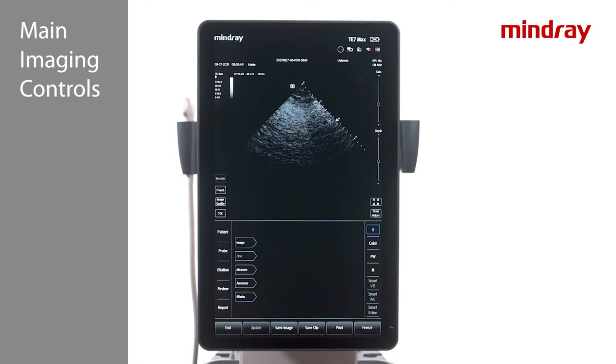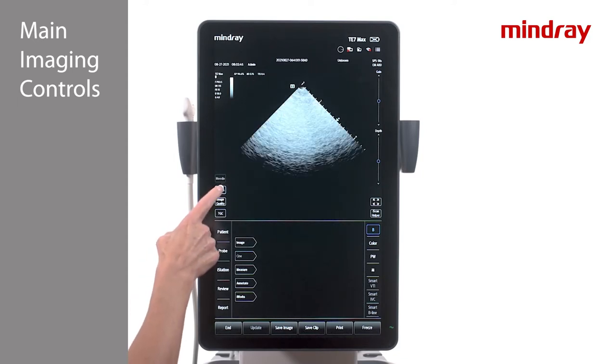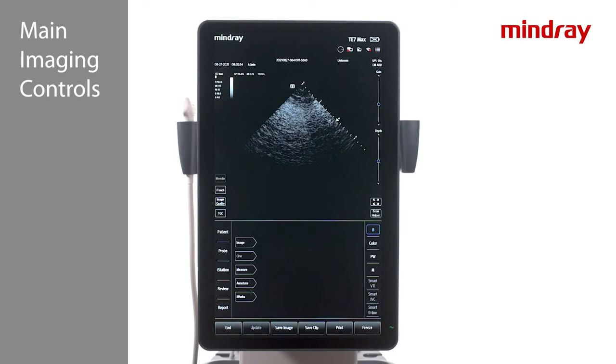On the left side of the touch screen is the iTouch key, which is auto gain optimization. Once it is pressed, the key will stay highlighted blue. To turn it off, press and hold the iTouch key. iTouch can be used in both B mode and pulsed wave mode.